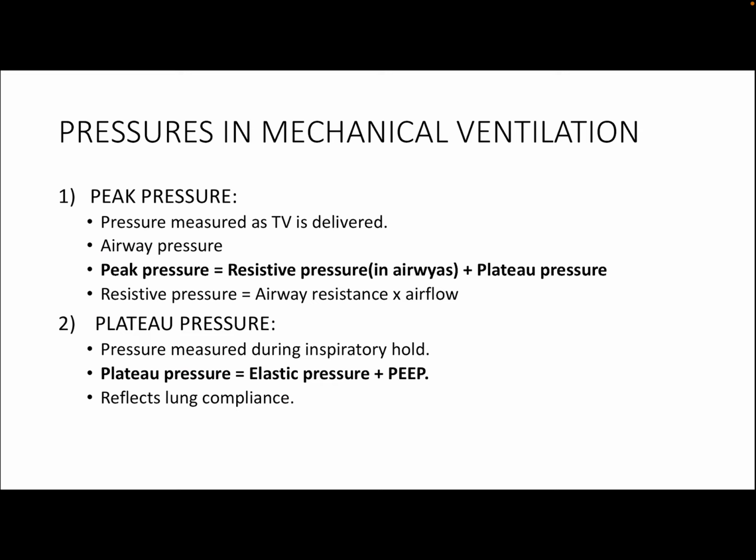Next, coming to certain important terms that are used to measure pressures in mechanical ventilation. Starting with the peak pressure. Peak pressure is the pressure that is measured as we are delivering the tidal volume. So it is essentially the airway pressure. You can think of it as a formula.